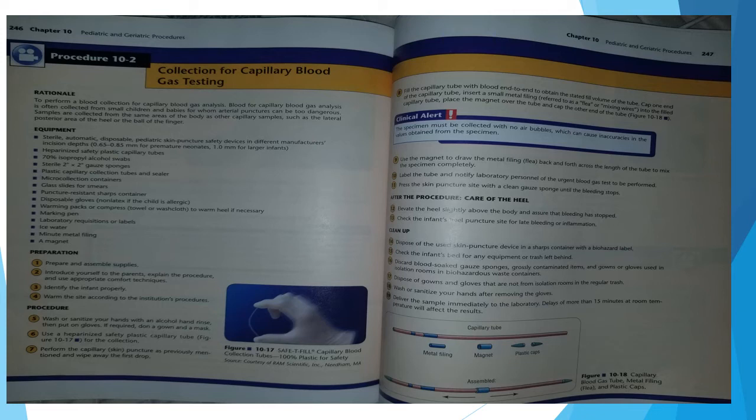The specimen must be collected with no air bubbles, which can cause inaccuracies in the values obtained from the specimen. Use the magnet to draw the metal filing flea back and forth across the length of the tube to mix the specimen completely. Label the tube and notify laboratory personnel of an urgent blood gas test to be performed. Press the skin puncture site with a clean gauze sponge until bleeding stops.